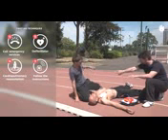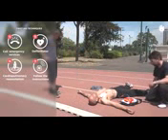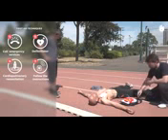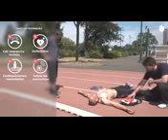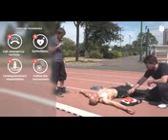Make sure that nobody is in contact with the casualty while the defibrillator is analyzing the casualty's heart rhythm. Follow the instructions of the device, which will indicate whether you should administer a shock or continue with chest compressions.